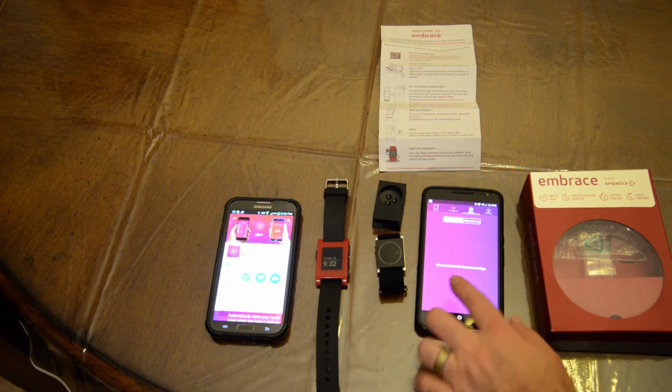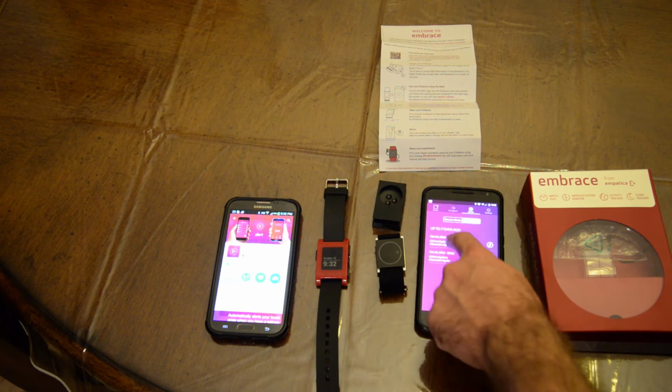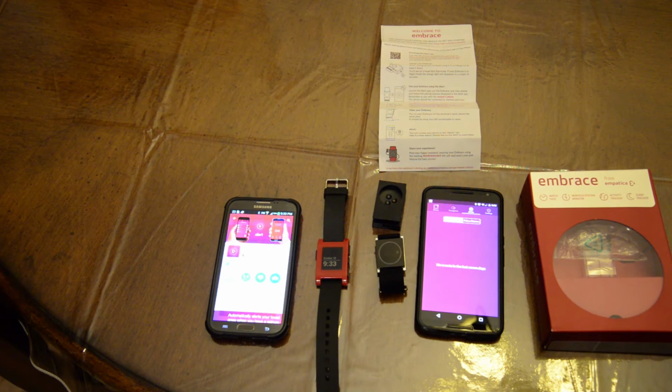When it gives an alert, it's going to go here as an actual alert. You'll select the alert, just like I do with the false positives, and it will tell you that it wasn't a false alarm, it was an alarm. Which is pretty interesting.